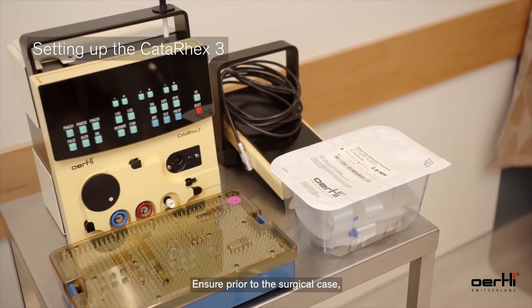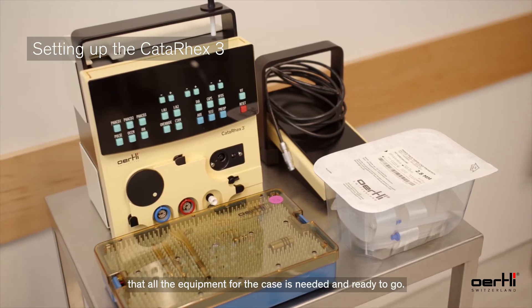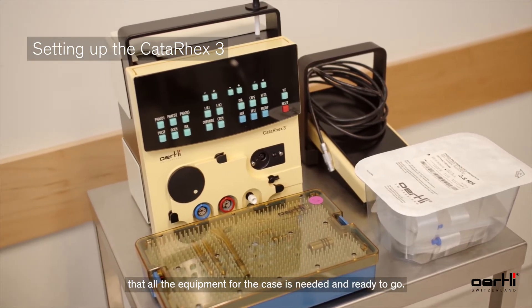Ensure prior to the surgical case that all the equipment needed for the case is ready to go.